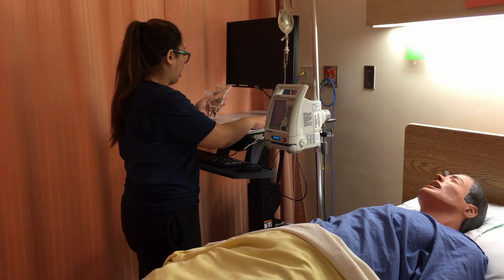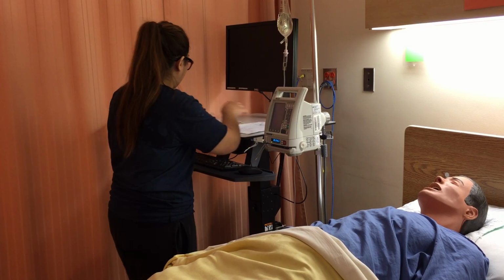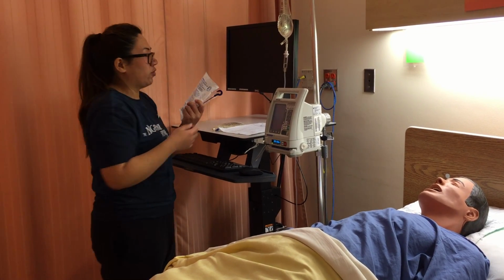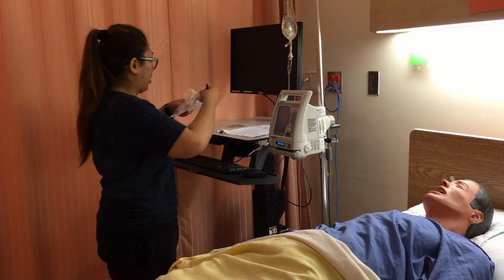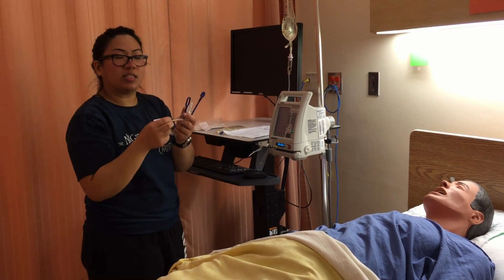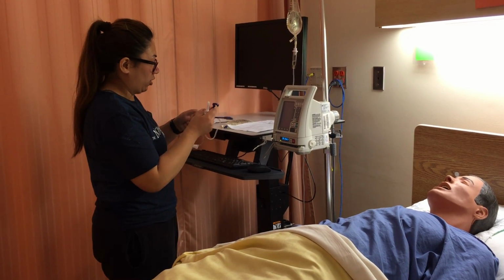Cefoxitin 750 milligrams, today at 1400 through an IV. Now we have to get our secondary medication set, and when we take this out, make sure that everything's intact and both ends are clean and closed.